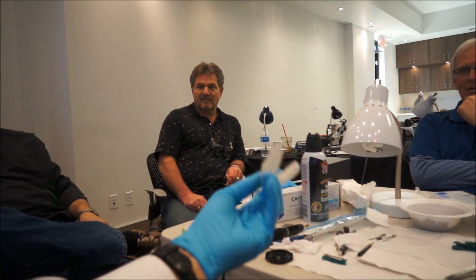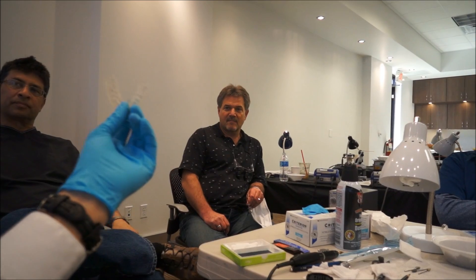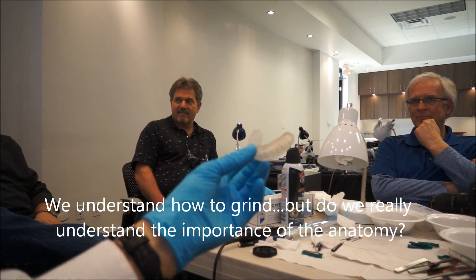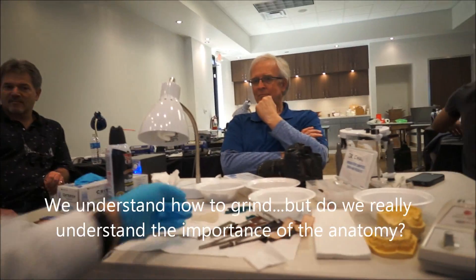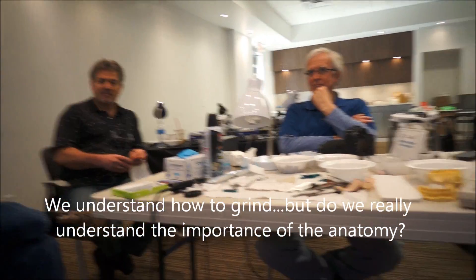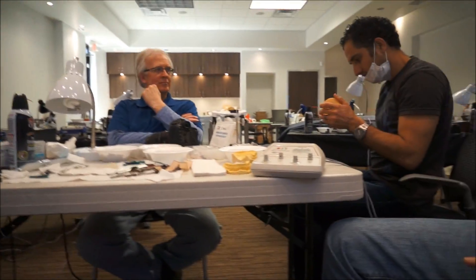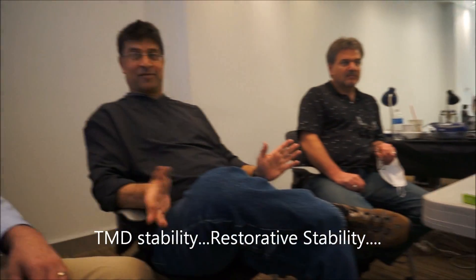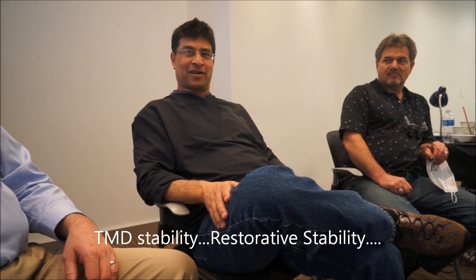The difficult part is when you start, it doesn't look anything like it's going to look. Remember, it started out as this big chunk. But we have envisioned what we want out of it to get the remaining part, and that's how form will follow function to create the feeling. Now I see why you make your own orthotic, because you have to do a lot of work to adjust the lab ones.